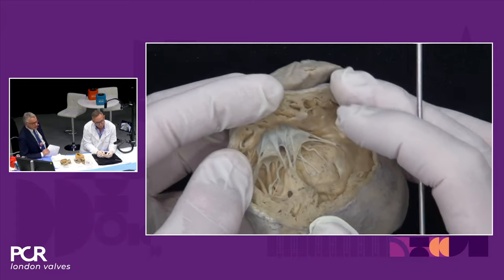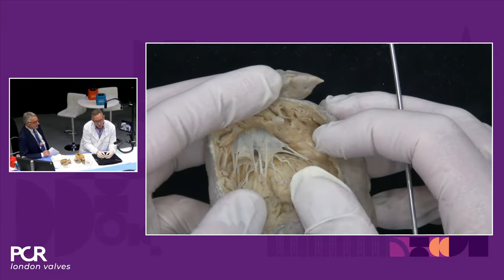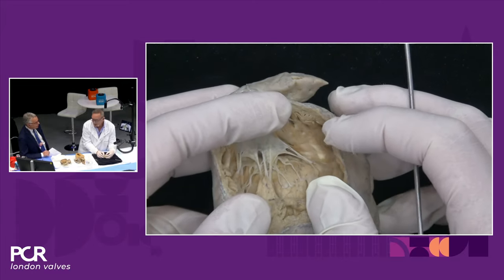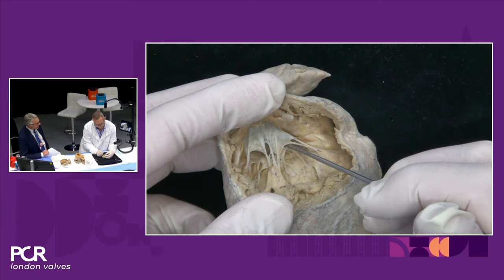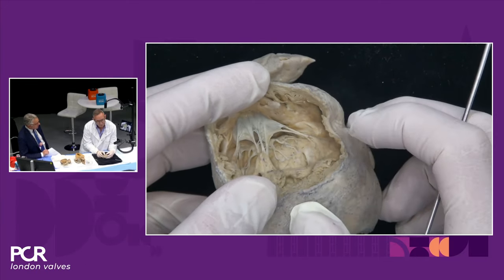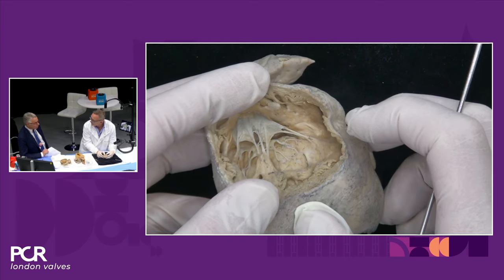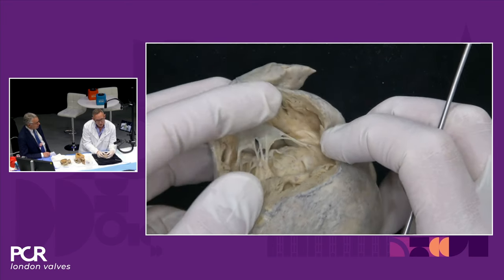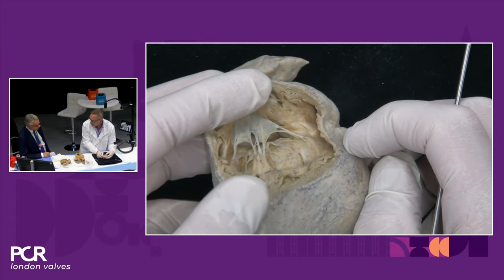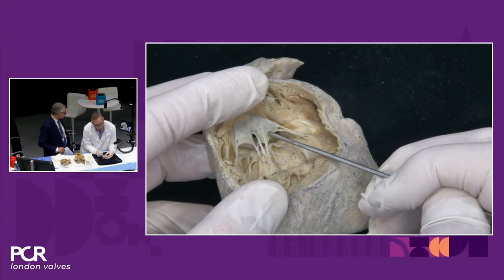But wait a second. This is maybe, for most of us, the first time we hear about a cord-free zone for the tricuspid. That is a key element, in my opinion. If we could see this on echo, this would be the ideal location for our implants. Absolutely, 100%. This is the easiest area.